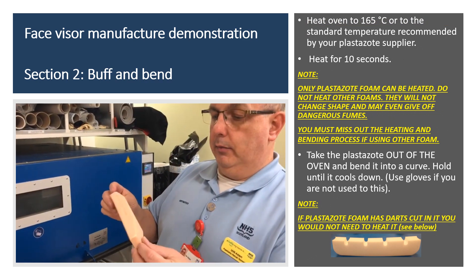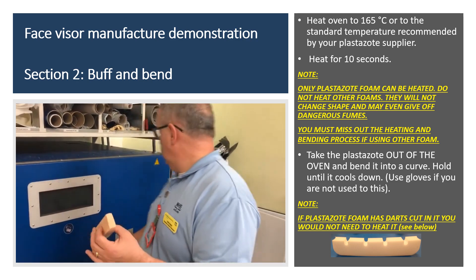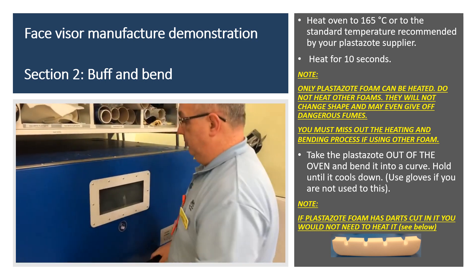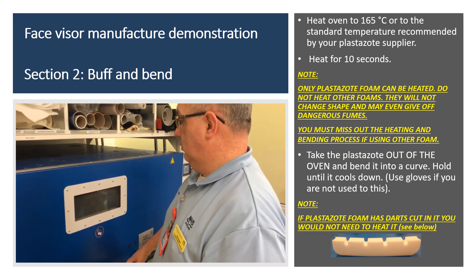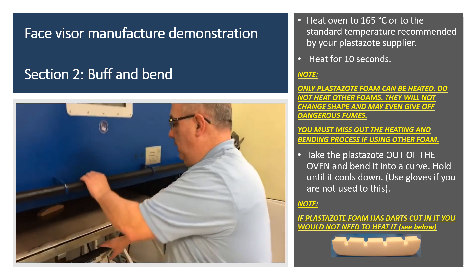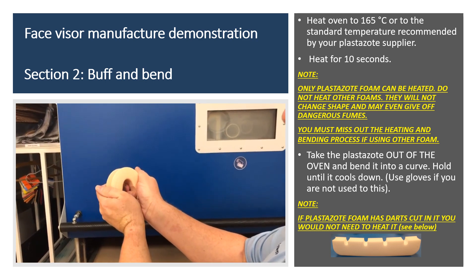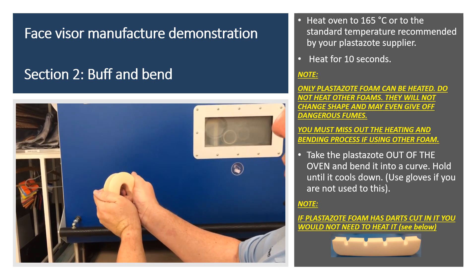So the first section was cutting and gluing, and this is buff and then bend. I've set the oven to about 165 degrees — this is going to go in for 10 seconds. Put it in the middle of the shape and just count on the camera. Then just grab it and twist it right round, near enough so it's touching, just about there. Hold that until it cools down. That should give us a pre-shaped curve.